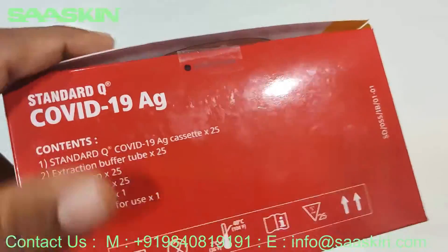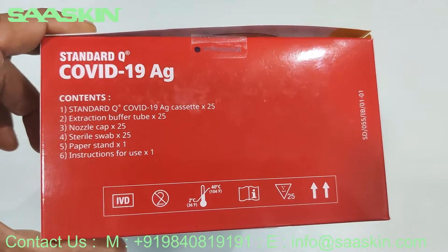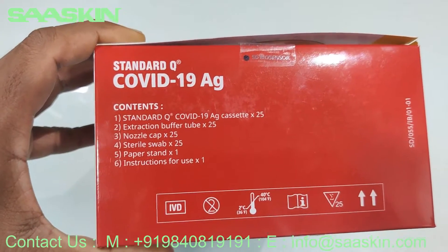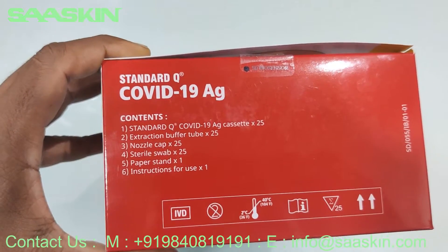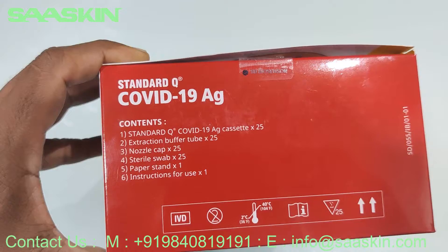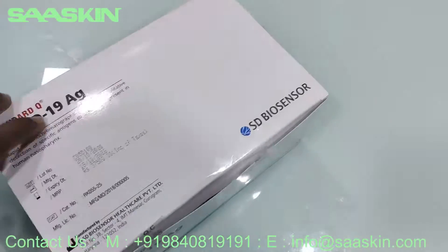Let me give you the contents in the box. The box contains 25 test cassettes, 25 extraction buffer tubes, 25 nozzle caps, 25 sterile swabs, one paper stand, and the instruction for use paper.